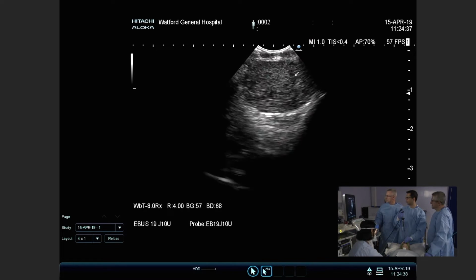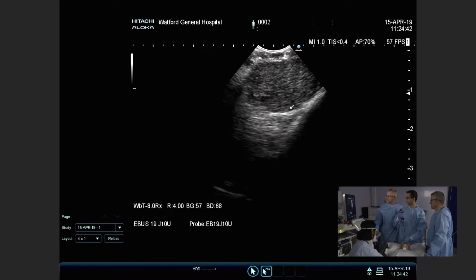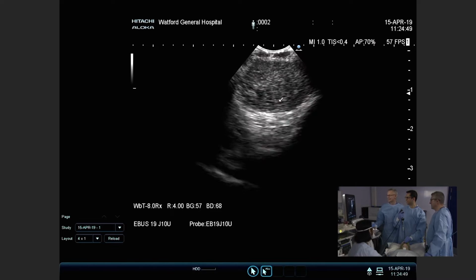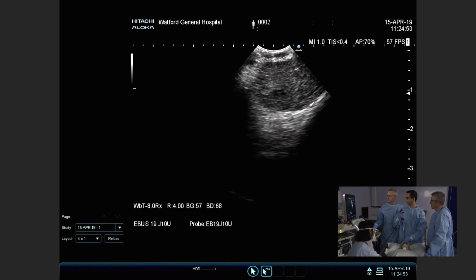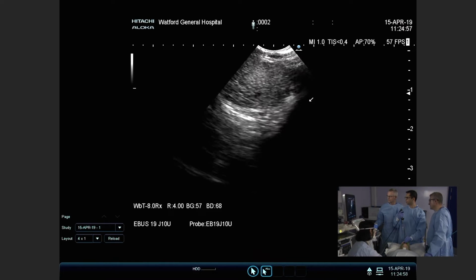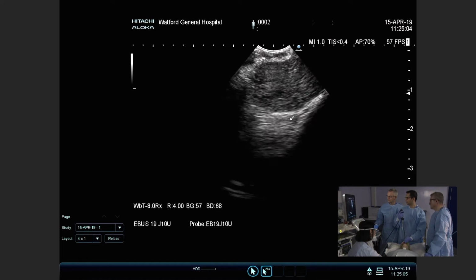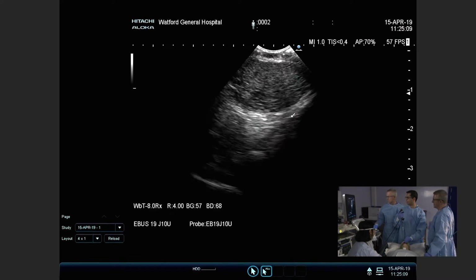1.8 centimeters. It's heterogeneous in terms of the echo architecture. There are areas of darkness, which Dr. McCrudden was just highlighting there, and that's central necrosis. If Rahul can just show us the entirety of the lymph node, I just want to see if we can find a hilar structure. There's an adjacent, separate node. I can't see a hilum there at all, so there's no central hilum. It's round and has distinct margins.